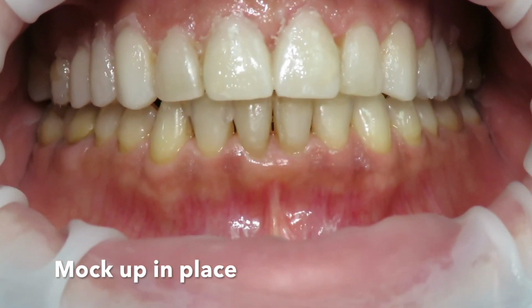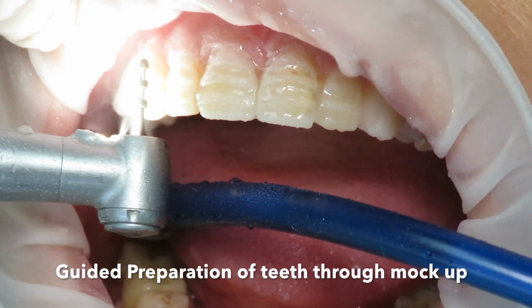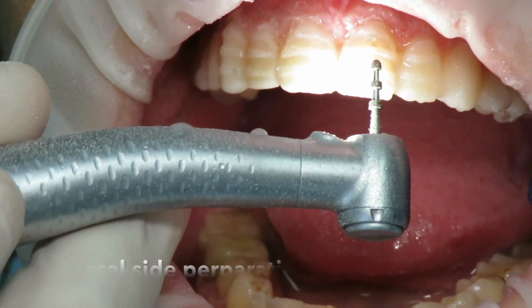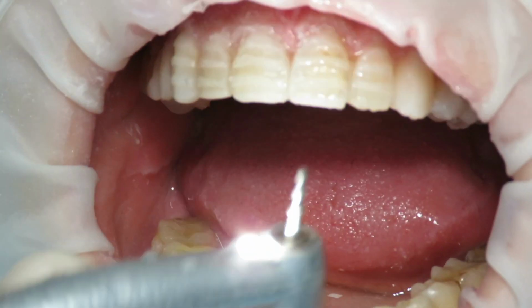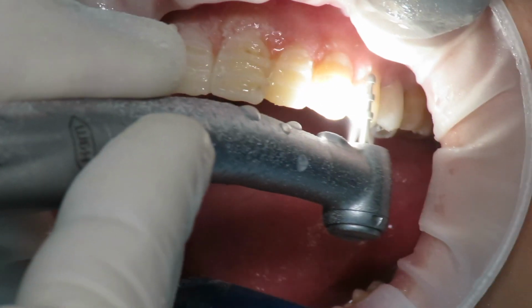Now the preparation will be guided by the mock-up, and you can see how we use this burr, which is a guided burr, by having three strips of 0.8 millimeter of depth.